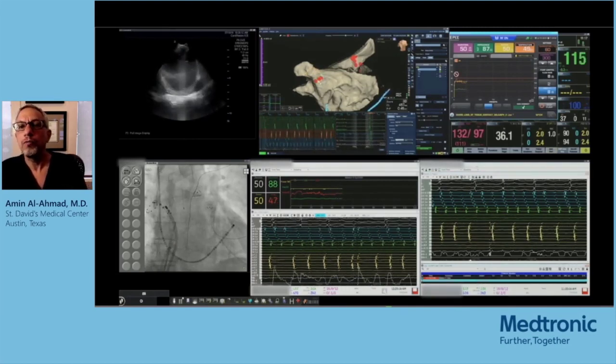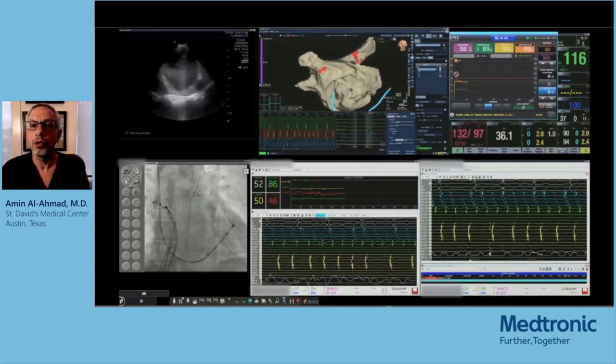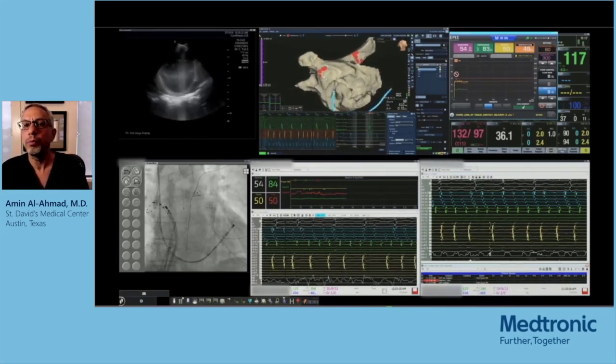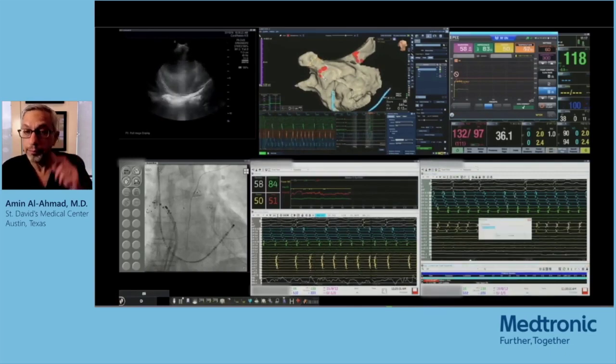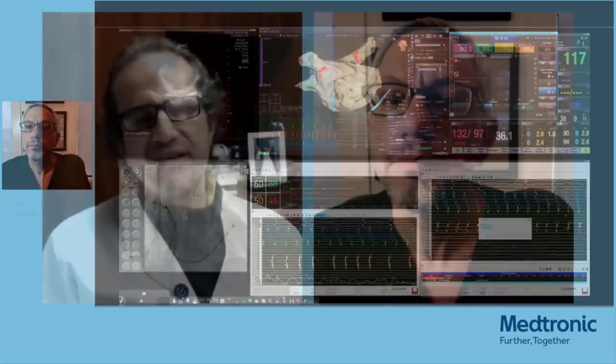You can achieve better contact, and the temperature goes up to the 50 degree plus range, and that's when you're getting a good ablation lesion right there. And again, you're using this 50 watts, considering that you have a non-deflectable sheath, as you mentioned before.